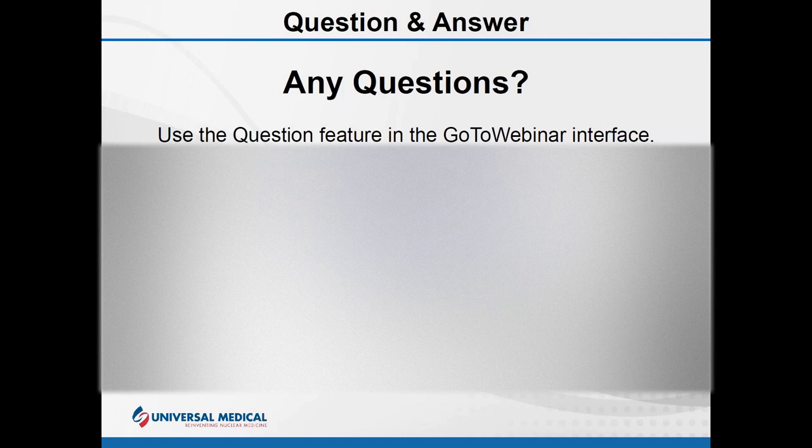Okay, so is it safe for the FSE to be in the same room as a patient being scanned? Yes, it is. Back to that last slide, we talked about the fact that you're getting 1/256th of the exposure the patient's getting, and they're only getting 15 millisieverts. So if you take 1/256th of 15 millisieverts, you're getting not very much.